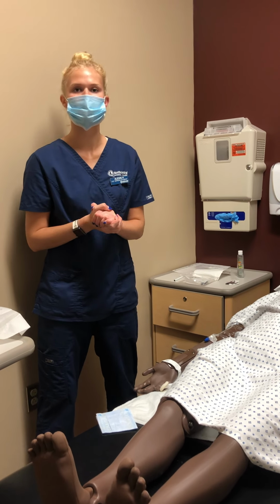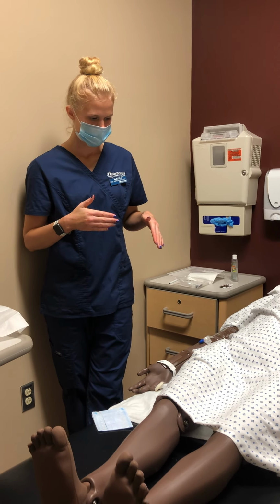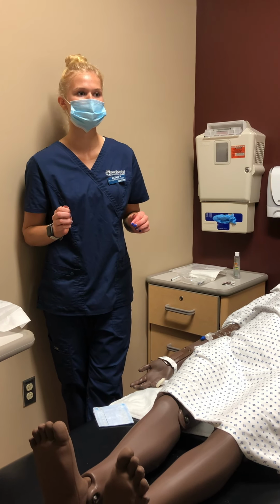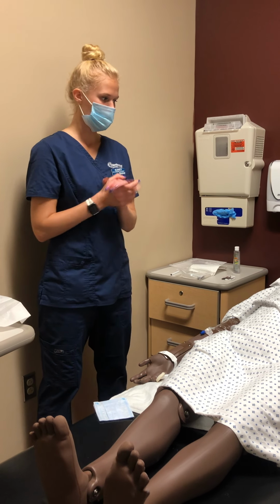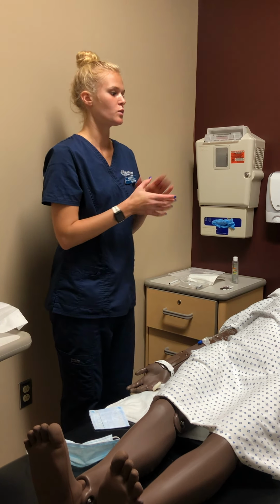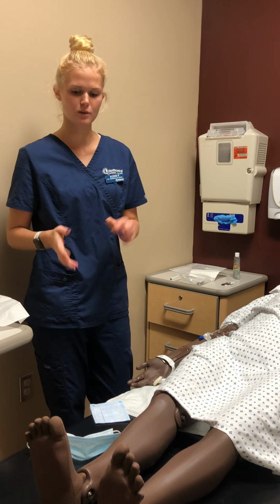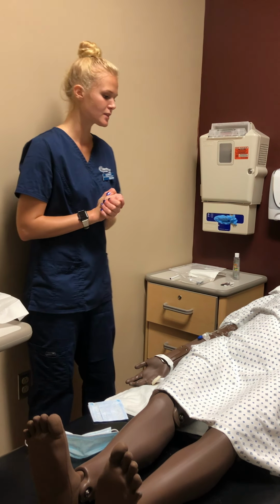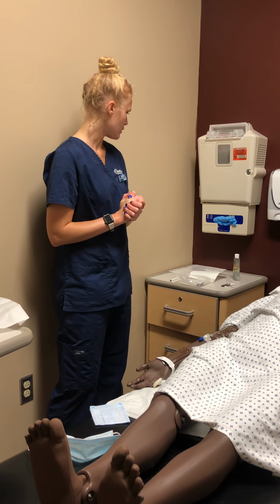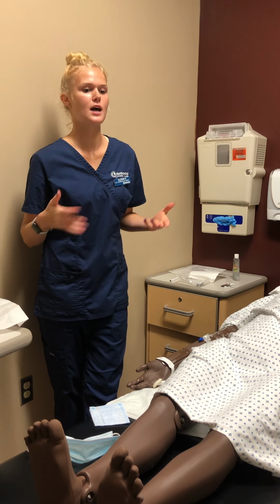take off my gloves, wash my hands. During my measurements, I want to make sure to inspect the cap, the hub to the site, and then I'm going to wash my hands, and then I'll take off my mask, dispose of that, and then wash my hands, and then take off my patient's mask. There you go. And then wash my hands again after I dispose of that. And then I would want to ensure that my patient's safe. So I'd want to make sure they have the call light, that they're in a low lock position.